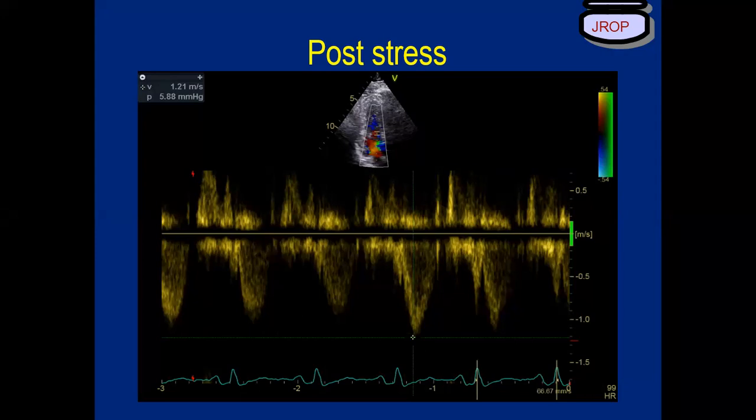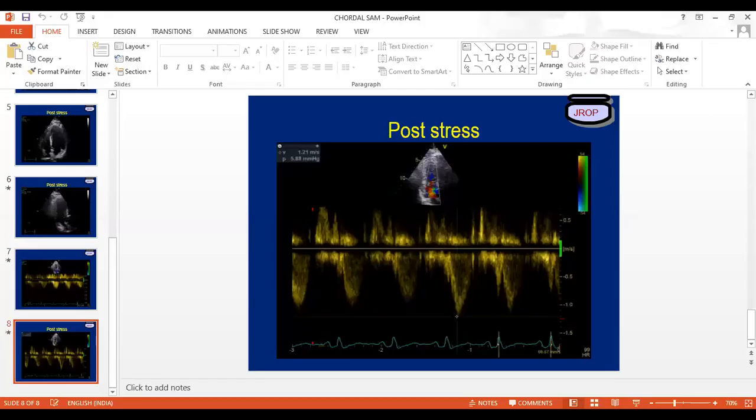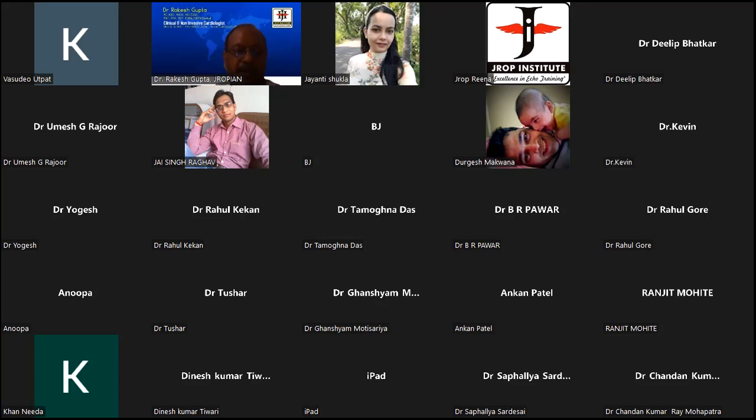Yeah, Ranjit. Sir, could you please explain the mitral inflow pattern and septal TDI pattern in grade 1 and grade 2 diastolic dysfunction? And also how it changes with Valsalva? Okay. So you want me to go back to my old cardiac clinics. Okay, I'll do that.